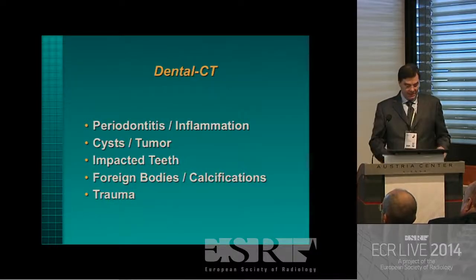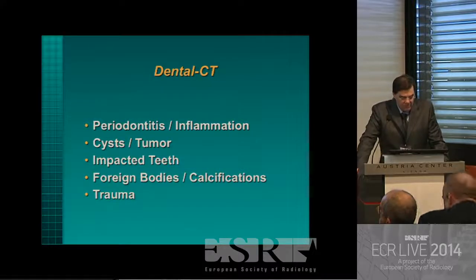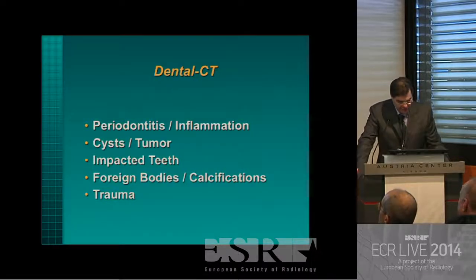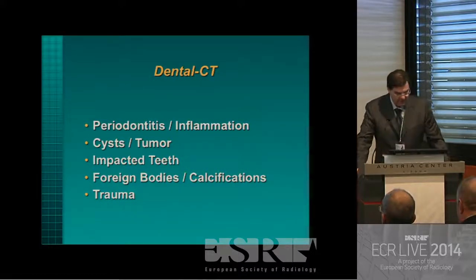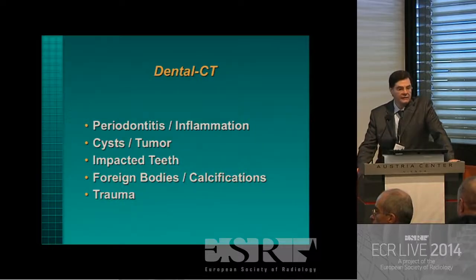So, to show you some of the more pathologic images or investigations which you can perform, I have just a short overview. I will show a few cases concerning each of these points. These are the main indications for doing dental CT next to implantology.